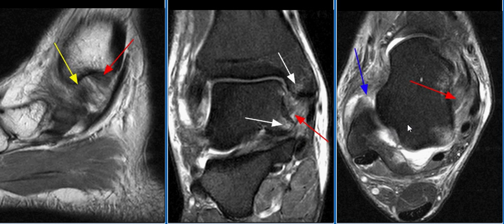The anterior talofibular ligament is also torn, with a stump of torn tissue seen anteriorly on this image with blue arrow.